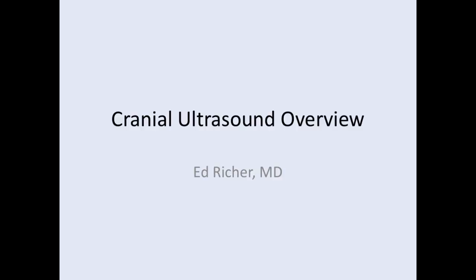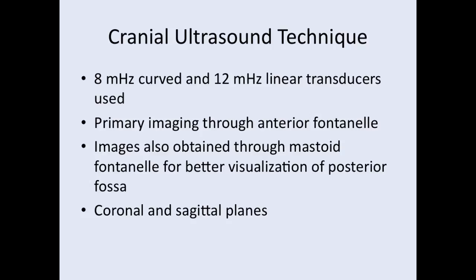This is going to be one of a few videos on cranial ultrasound. This first video is going to be on normal cranial anatomy. For cranial ultrasound technique, we use both 8 megahertz curved and 12 megahertz linear transducers, and we primarily image through the anterior fontanelle. We also obtain some images through the mastoid fontanelle, which is posterior to the ear, giving us better visualization of the posterior fossa structures such as the cerebellum.